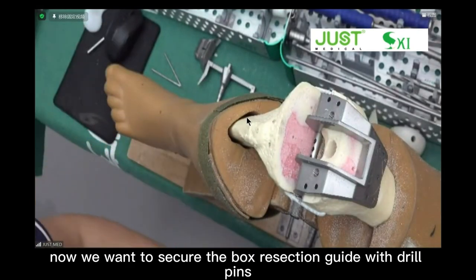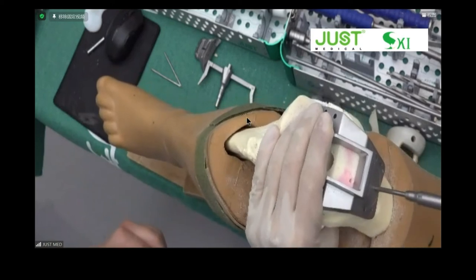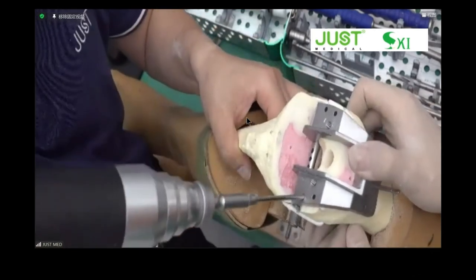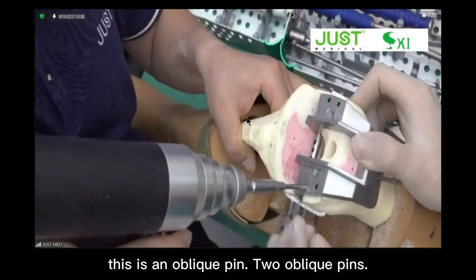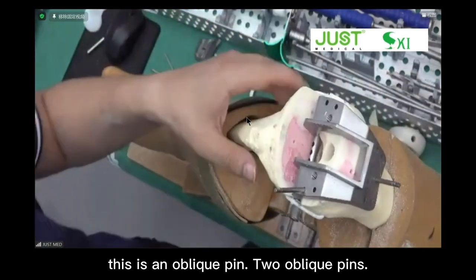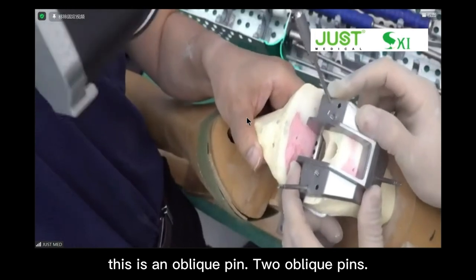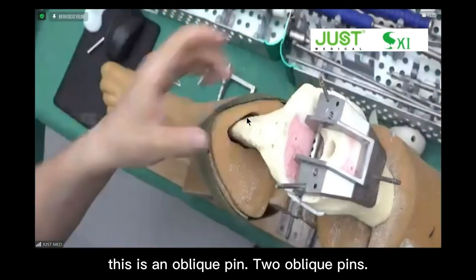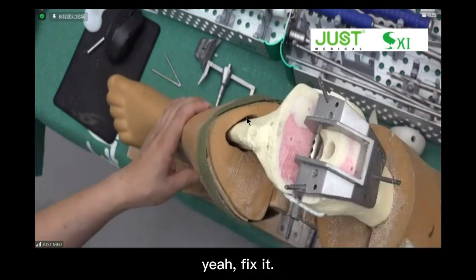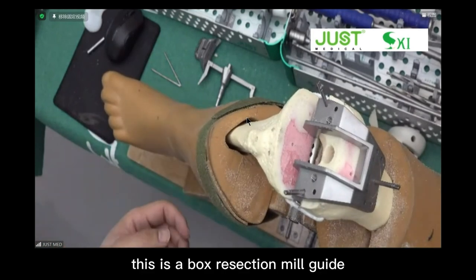Now we want to secure the box resection guide with the drill pins. This is an oblique pin. Yeah, two oblique pins. And it's a little bit curved. Yeah? This is a box resection guide.